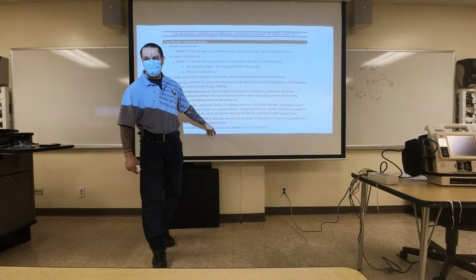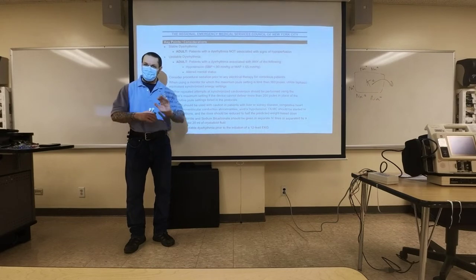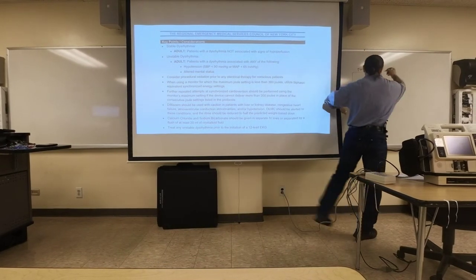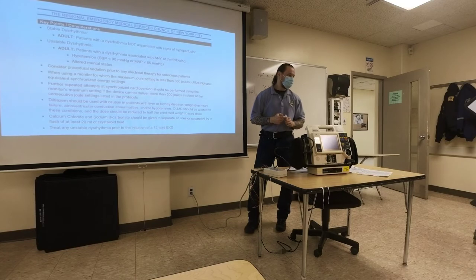They brought the patient to the hospital, right? The hospital put their own pacer on, and they paced. And they called the tech to do an EKG, and the tech came. The tech obviously doesn't know to turn off the pacemaker. He did a 12-lead with a paced rhythm. So it basically shows you a rhythm like this, right? It's non-diagnostic, right? You'll see a pacer spike and a QRS for all your leads like this, for all of them. So you cannot determine ST segment changes.